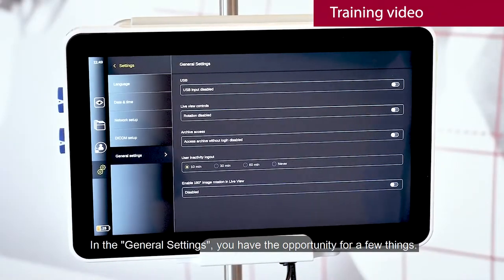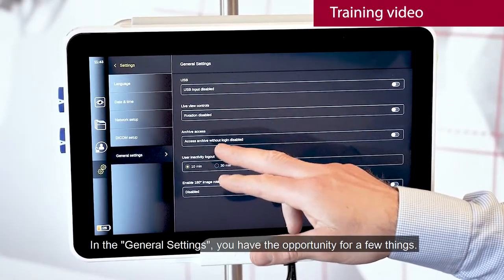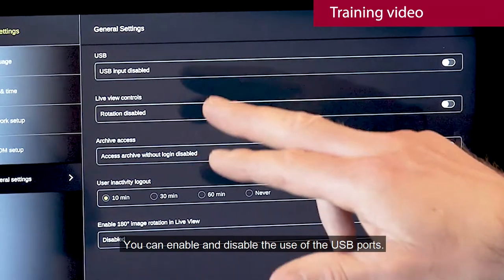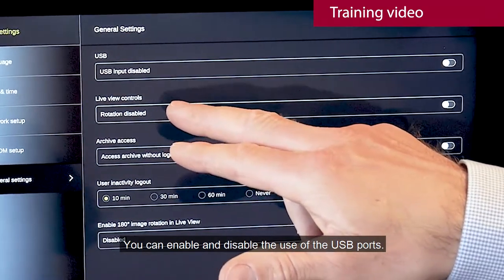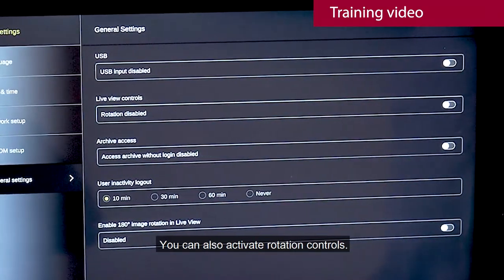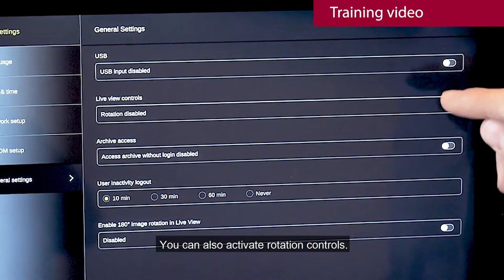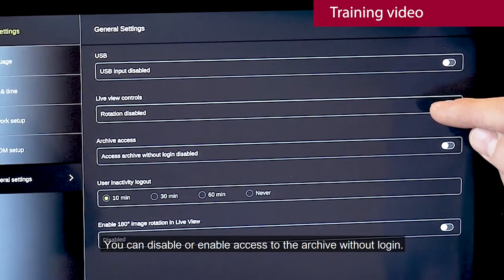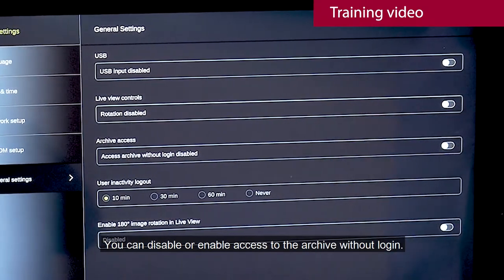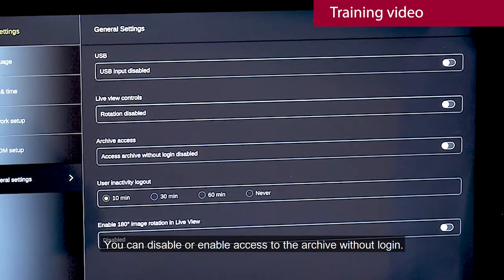In the general settings, you have the opportunity for a few things. You can enable and disable the use of the USB ports. You can also activate rotation controls. You can disable or enable access to the archive without login.